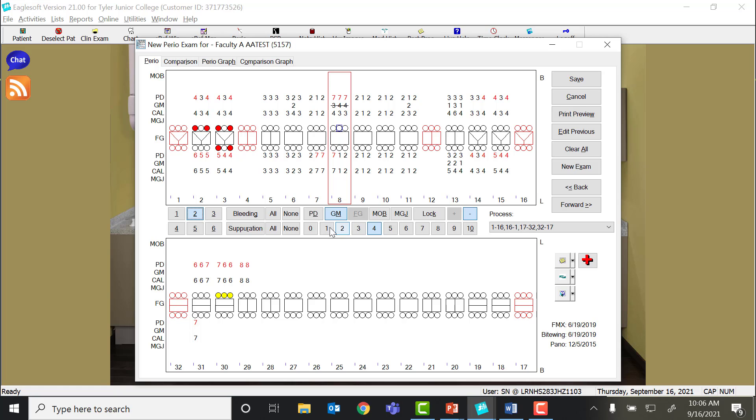If a patient has mobility on a tooth, then you'll click the mobility tab and it gives you selections 0-4, as those are your only options on mobility grade.